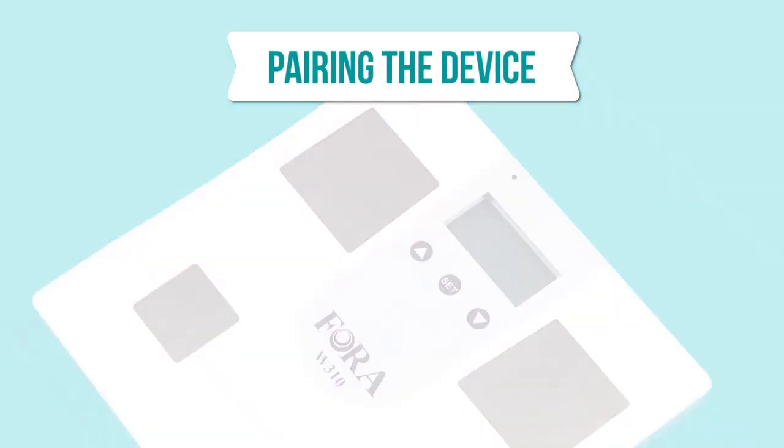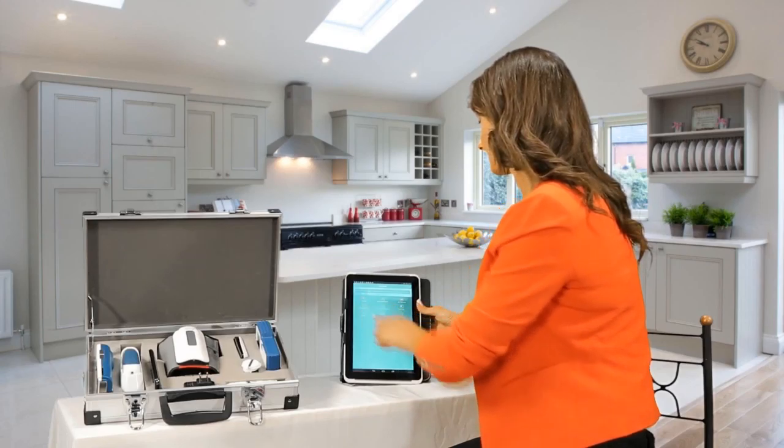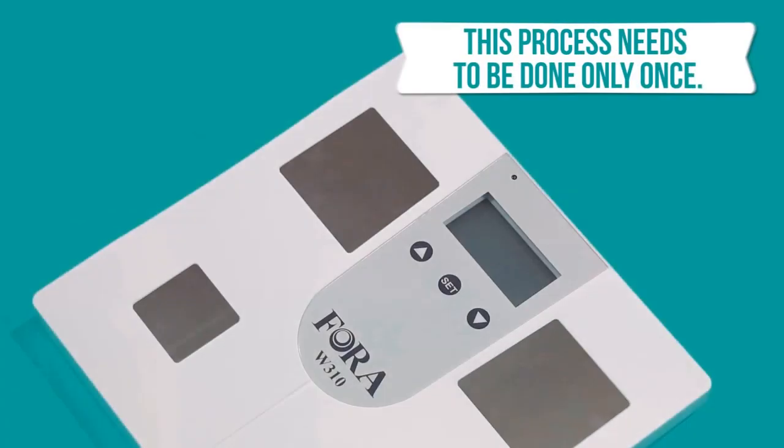Pairing your weight scale device. If your meter is a new unit, make sure you pair it with your tablet or smartphone first. This process needs to be done only once.